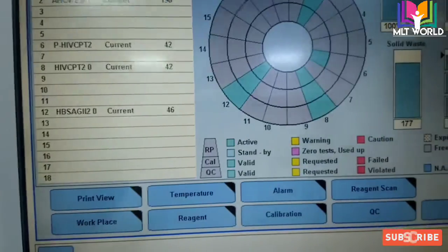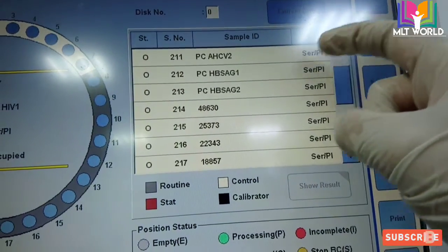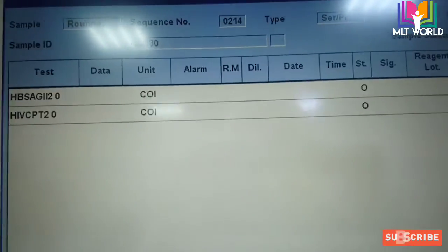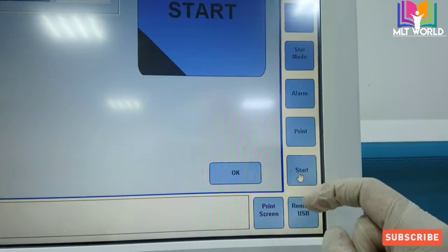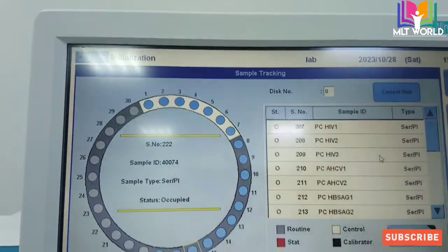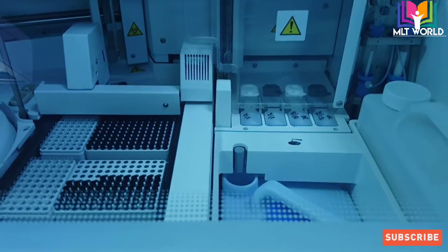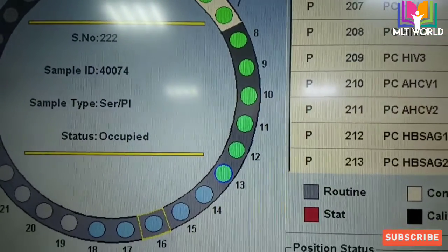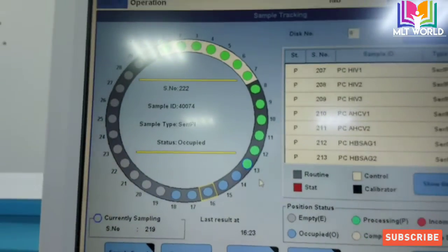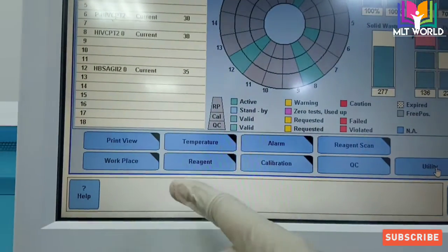After programming, go to Sample Tracking, click Show Result, and you will see the scheduled tests. Click Start and then Start again. First the machine will go through initialization — it scans and checks everything. After initialization, sample aspiration will start. Once a sample is aspirated, its circle turns green. A green circle with a blue ring means the sample is currently being aspirated. Once the test is complete, the circle will turn white.